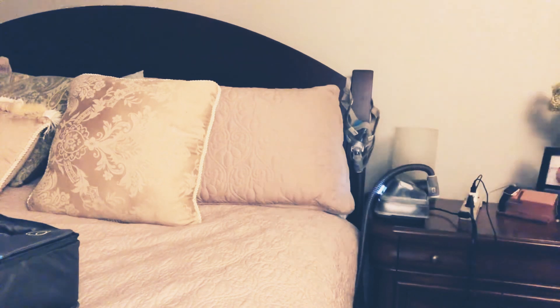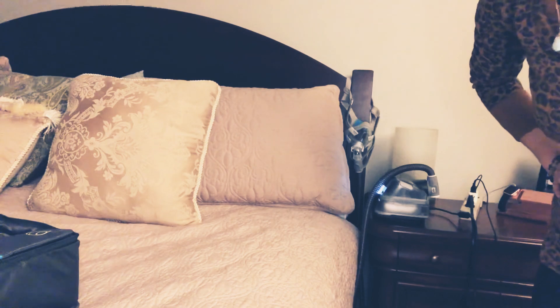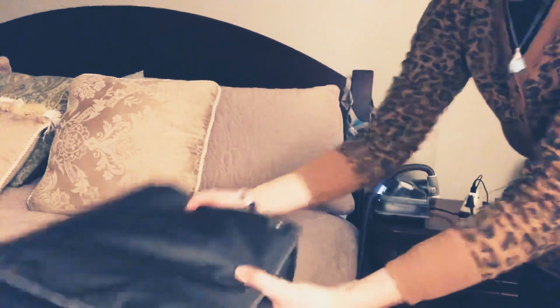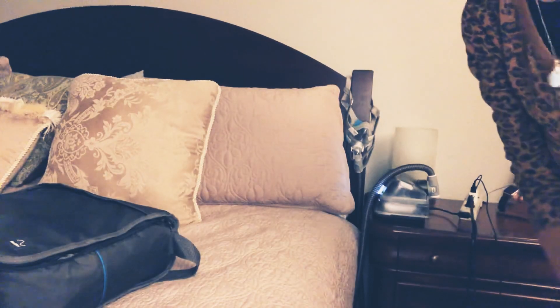That's how you set up your CPAP when you get home. I hope you guys have an awesome night. Don't forget to put your CPAP travel bag in a safe place because when you travel, you're going to need it. You guys have a great one.